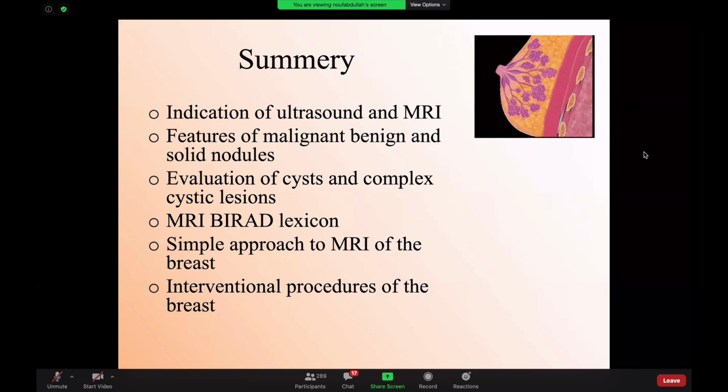Okay, Dr. Talal is asking, could you repeat the indications of stereotactic guided biopsy, please? The stereotactic guided biopsy is usually used for microcalcification most of the time. As I told you before, for any microcalcification, your next step is you do a magnification view and a true lateral magnification view. Once you identify that this is suspicious, your next step is you do ultrasound. Why?